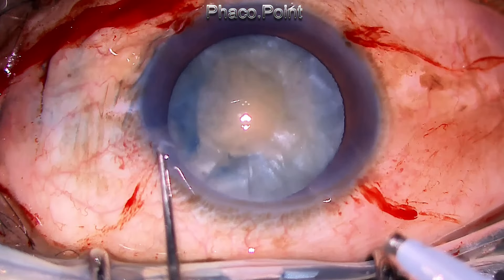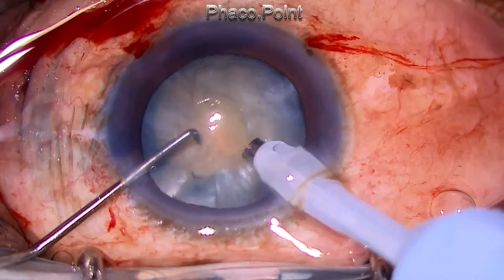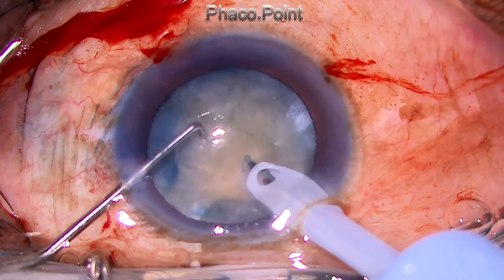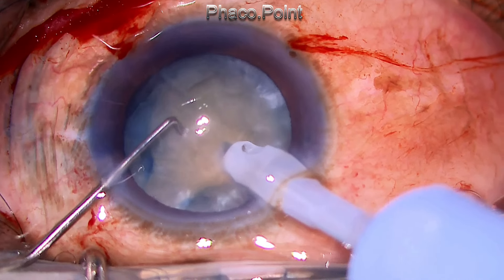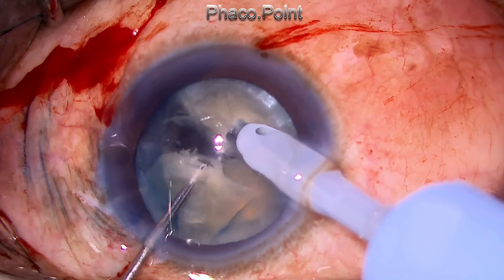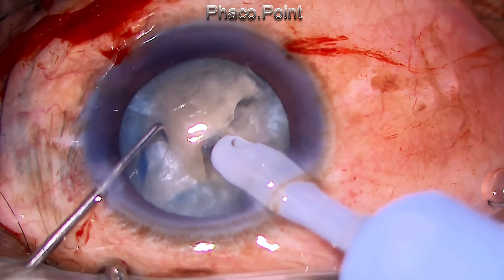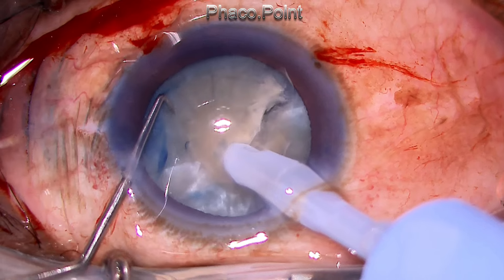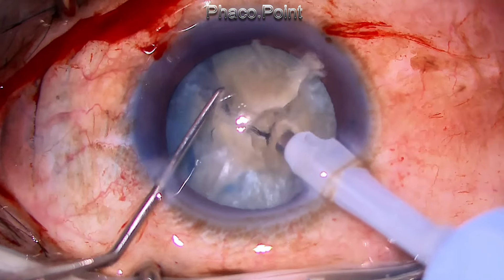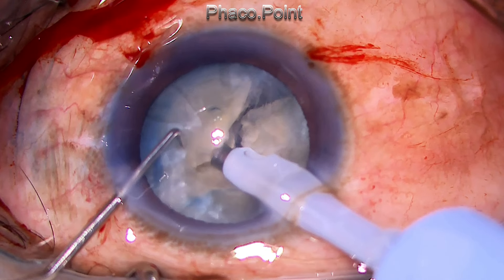What was in my favour was the fact that this cataract is probably soft and chalky — just a 45-year-old male — I didn't expect it to be very hard. This nucleus was just about a grade 2 with very chalky contents, and I found it a very simple matter to chop this lens from the mid-peripheral point, which is my technique of performing the direct FACO chop.